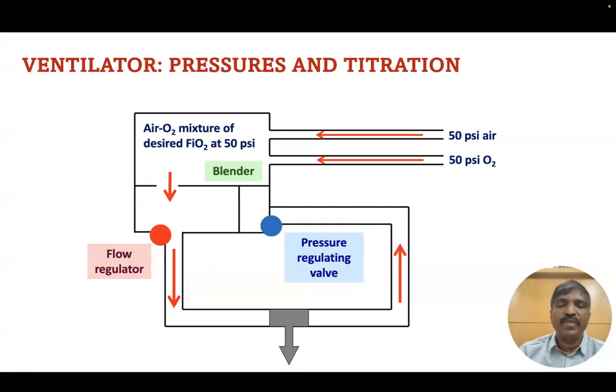At the end, when the expiratory circuit goes back to the ventilator, you have an expiratory valve, depicted here with the blue circle. There is a gas flow in the circuit, and this gas flow is obstructed by this blue circle. Thereby, the pressures are built in the circuit. And when the pressures are built in the circuit, part of the gas will go into the patient's lungs, which is connected to the Y piece, which is connected to the gray arrow.